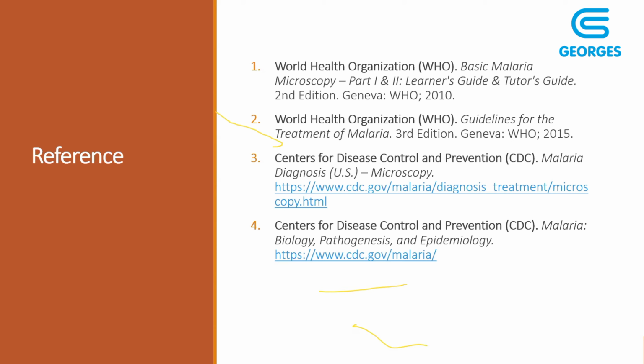Then we also have another question here from Hassan Juma. Can we truly identify species in QBC method? The answer is no. We cannot identify species in QBC method. QBC is a rapid screening method, and after we identify the malaria in a QBC method, then we need to switch to the slide method, whereby we can be able to do species. Peter mentioned that species is best identified using the thin film. So after we do the QBC, we switch to the thin film for species identification.